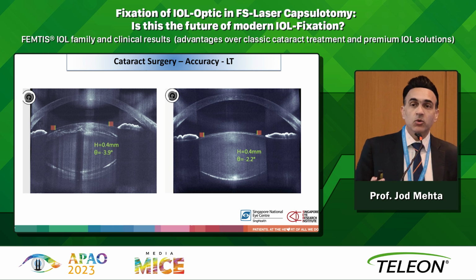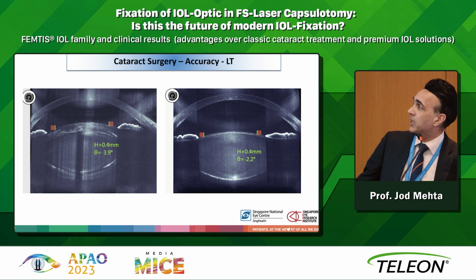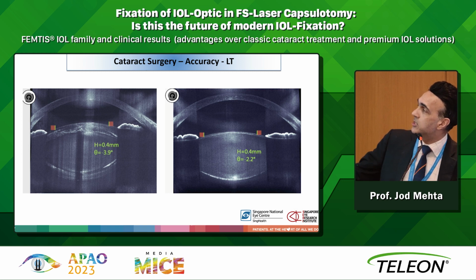And we never look at bag sizes at all because we don't measure it. You measure this with a femtosecond laser when we're removing the lenses, but we never consider the bags when we're putting lenses inside the eye, because what we're trying to do is not break the posterior capsule and put the lens inside the bag itself.